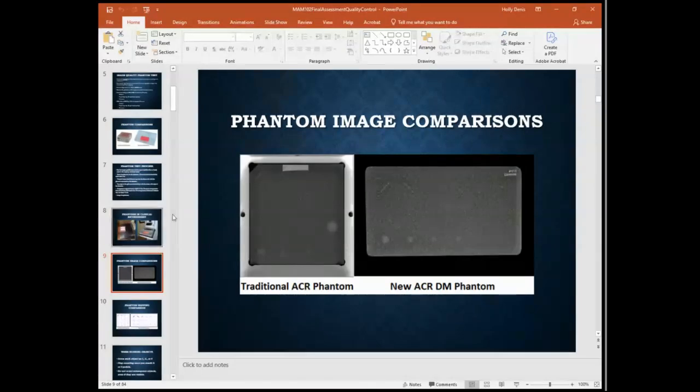on this image. And then we've got some specs, and I can barely see the specs on mine. I can see 1, 2, 3, 4, 5. There should be one over here that I really can't see. And then I can see some down here, but I can't count them because, and we'll talk about that later. But anyways, this is what they look like on an image. And if that was the only thing that I saw, then this wouldn't pass. But it's just because it's on a PowerPoint.